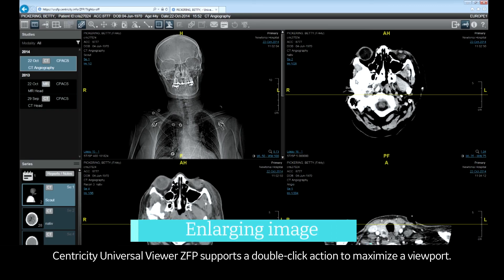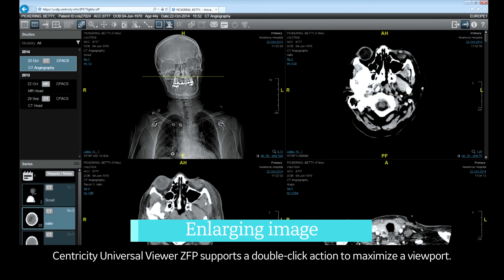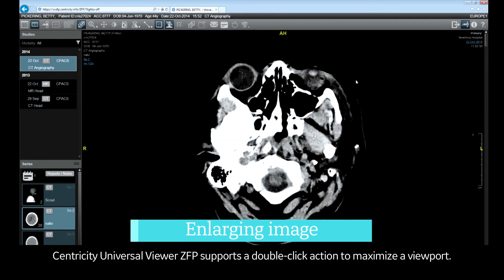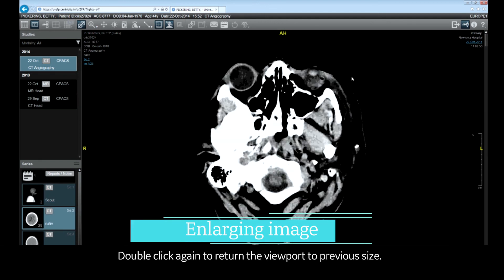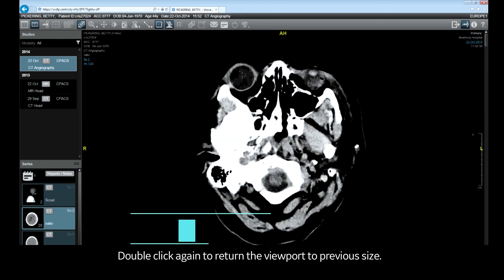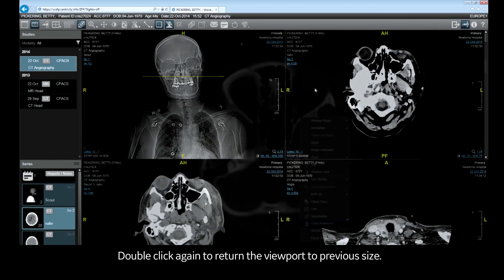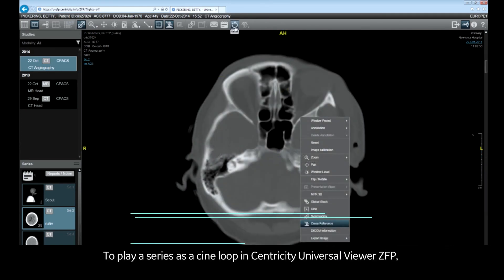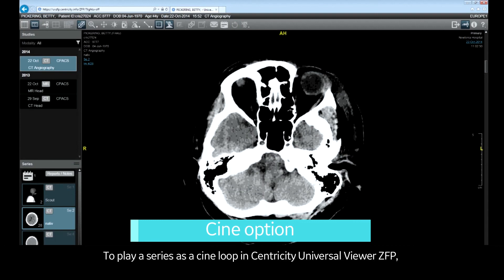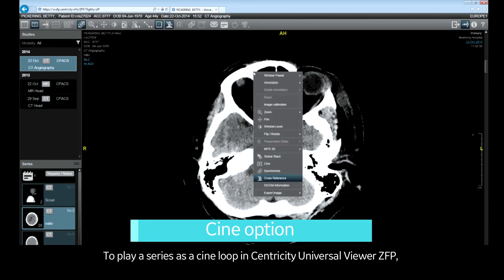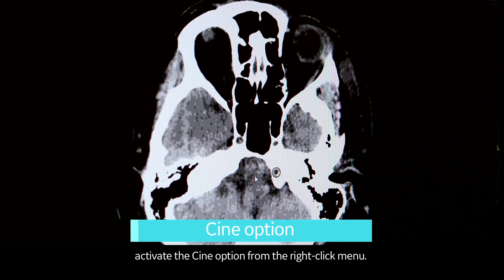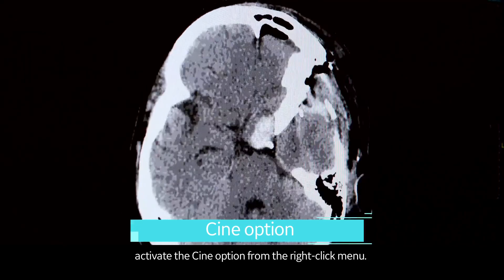Centricity Universal Viewer ZFP supports a double-click action to maximize the viewport. Double-click again to return the viewport to its previous size. To play a series as a CINE loop, activate the CINE option from the right-click menu.